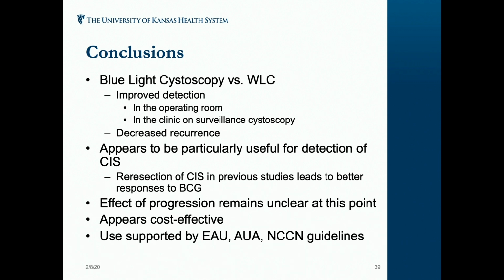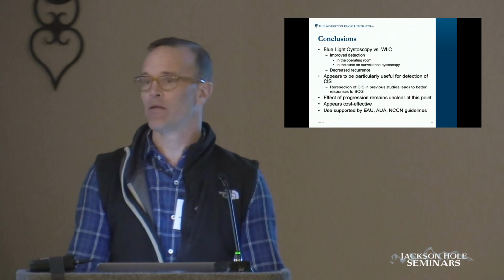So I think it's particularly important for detection of CIS. It does appear to be cost-effective, and it is supported by the use of guidelines.